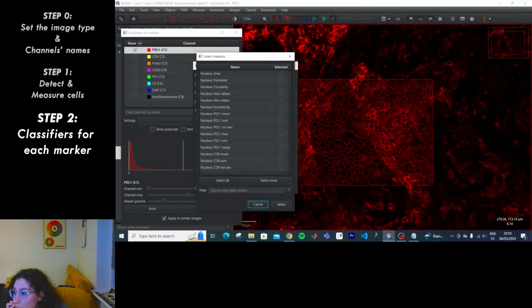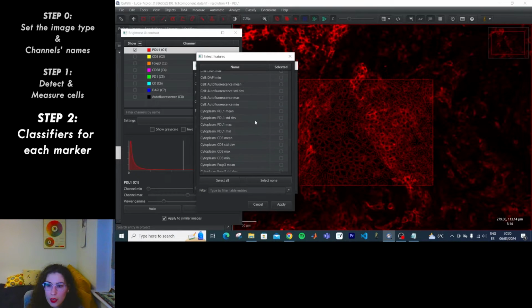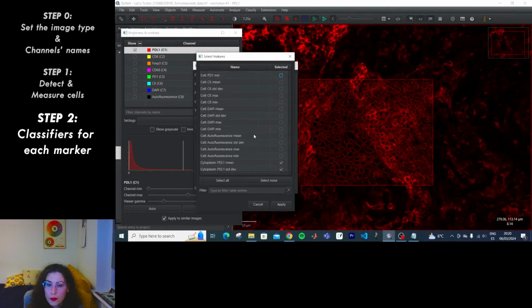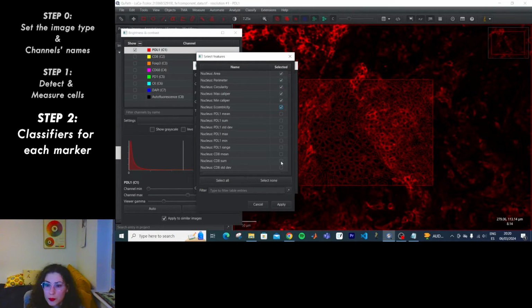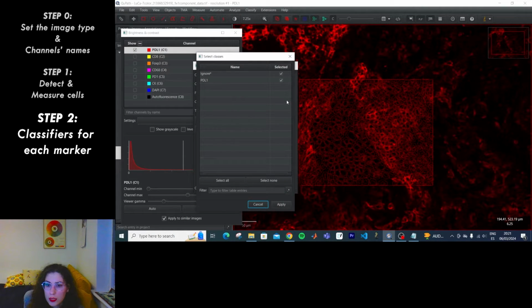Okay. Which ones am I supposed to select? What I'm gathering is this tutorial is a bit difficult to follow if you don't know what you're doing. Okay, so for PDL1, let's use all of the PDL. Well, not the nucleus one, because it's not even a nucleus. So cell PDL1, cytoplasm PDL1. Let's start with that. And let's include the general. Okay. Apply. Those are the features that I want. Classes, selected classes, select. Yes, 2 classes.